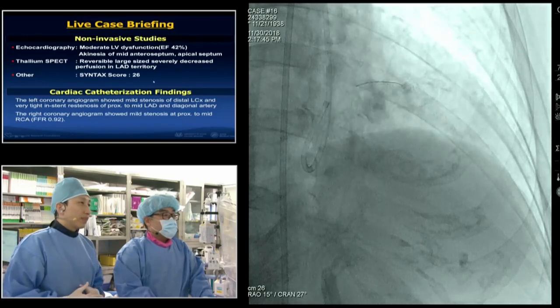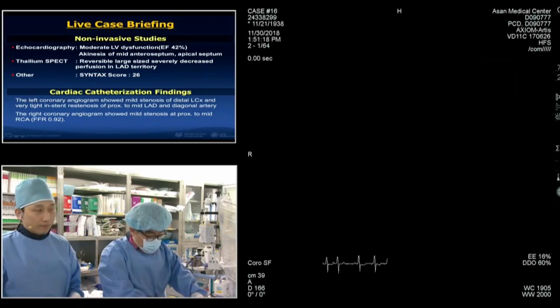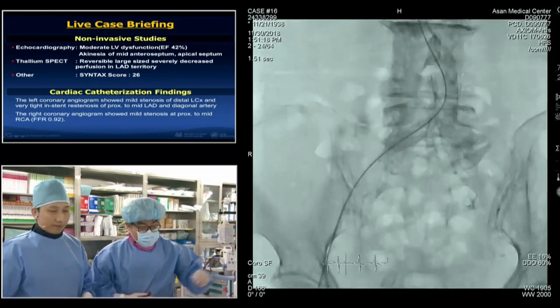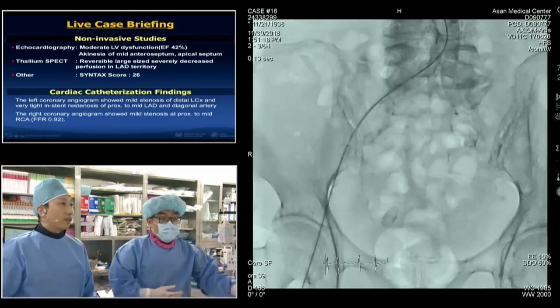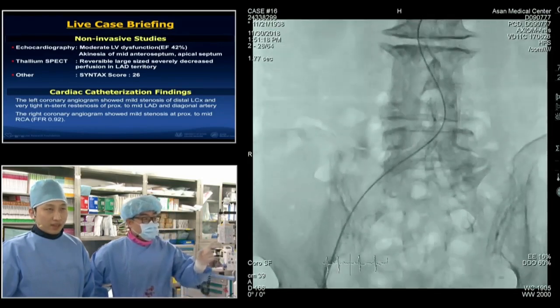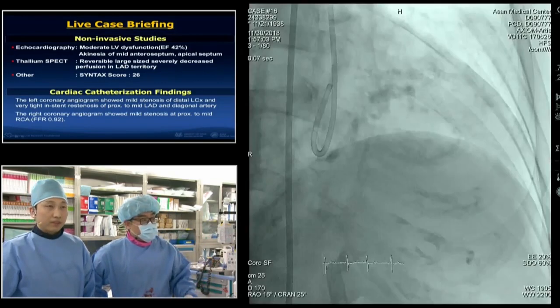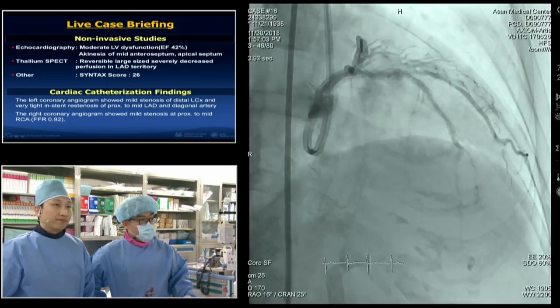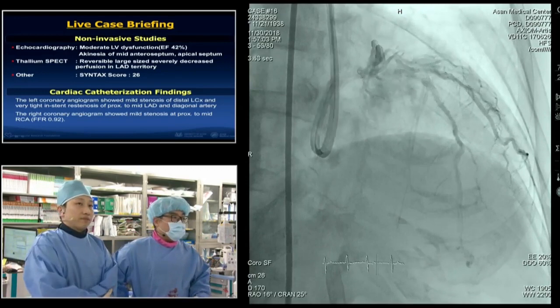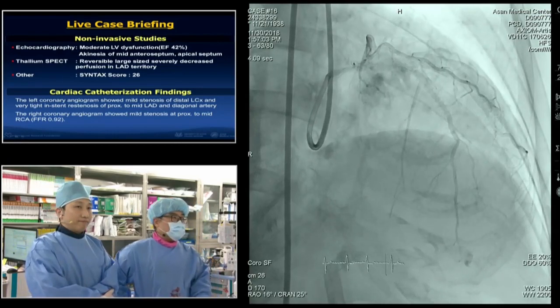Would you show us the baseline angio? Yes, let's go to the first angio. Great. The history is a very interesting one. She had a provisional T stenting with the old Cypher, more than a decade ago. She had critical restenosis at the bifurcation. This was the initial shot, and you can see the distal abdominal aorta is quite tortuous, but we set up a 7 French guide without too much difficulty. And this is the first shot today. We can appreciate the previous Cypher at the LAD diagonal bifurcation and a very tight stenosis just distal to the bifurcation.